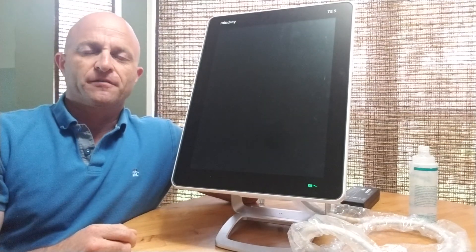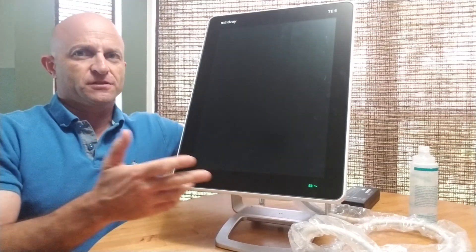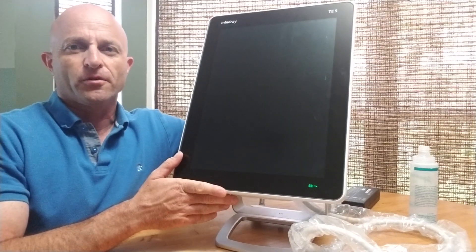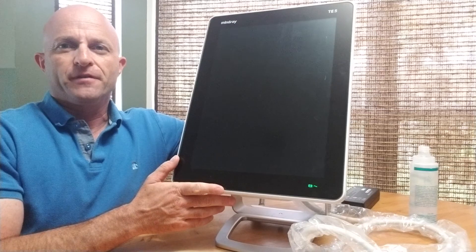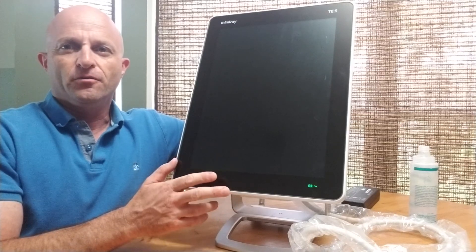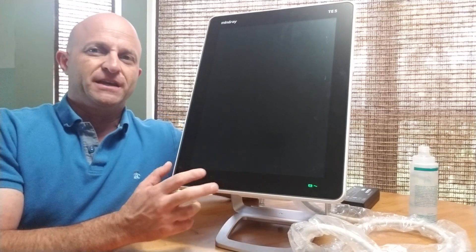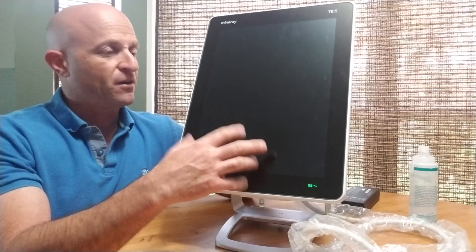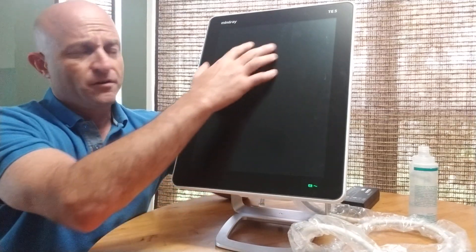Hey, this is Jeff with Complete Medical Services. I wanted to do a quick walkthrough of the new Mindray TE5 MSK ultrasound, fully touchscreen.